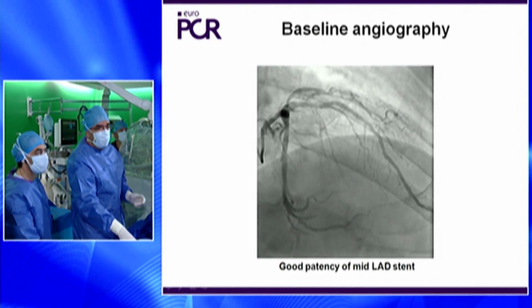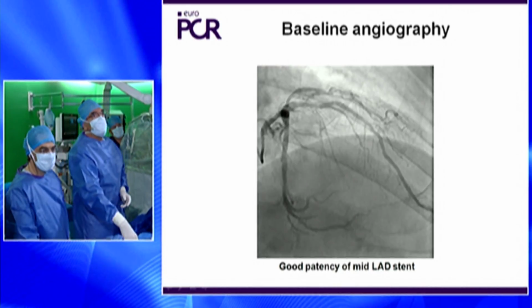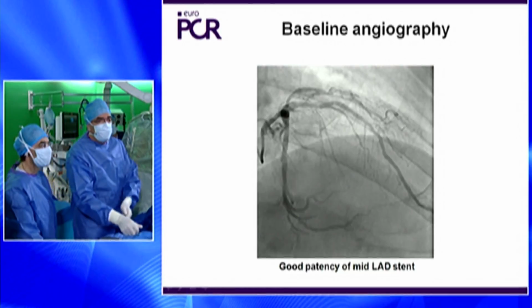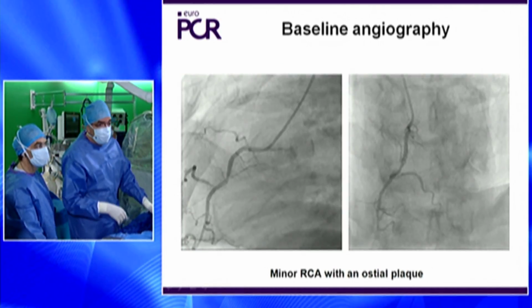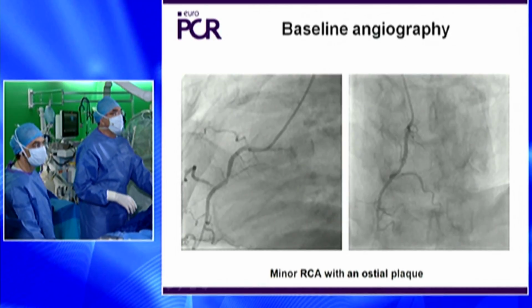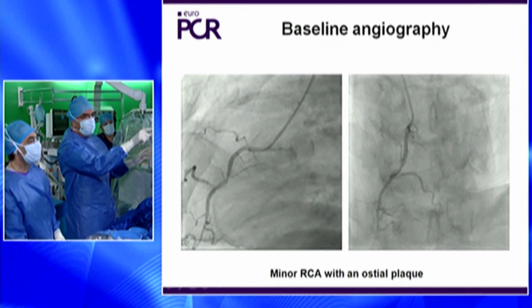I think that it's a dominant circumflex artery. You could see that the patency of the stent in the mid-LAD is perfect. And this is a very small right, so it's a large left dominant artery. So now we will show you what we have done.